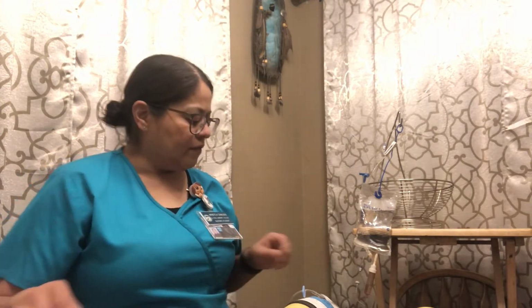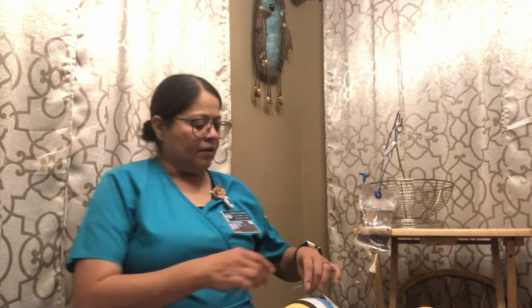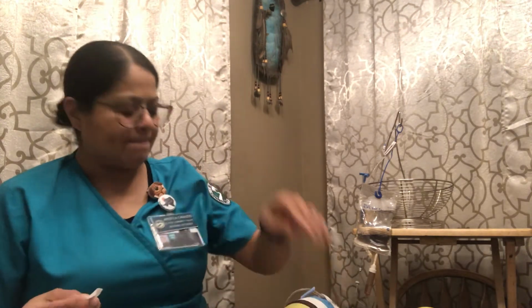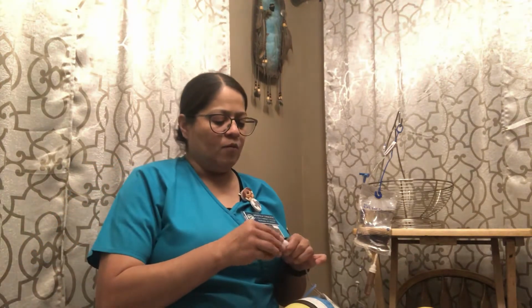Okay, so the first thing I'm gonna do is go ahead and I would put my gloves on. I'm gonna unclamp the port. I'm gonna remove the port cover. Get an alcohol swab. And I'm going to clean the port for 15 seconds. I'm gonna go ahead and let it dry. And then I'm going to get my flush.